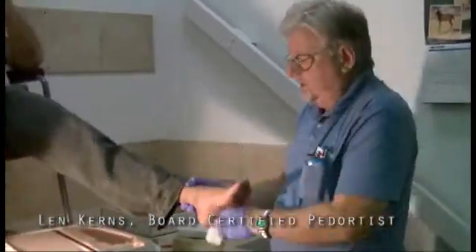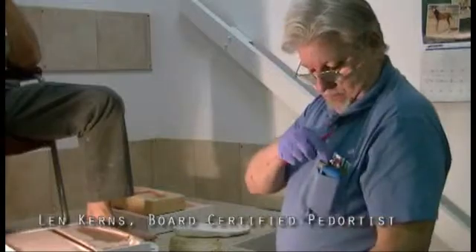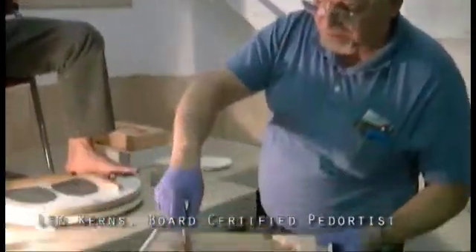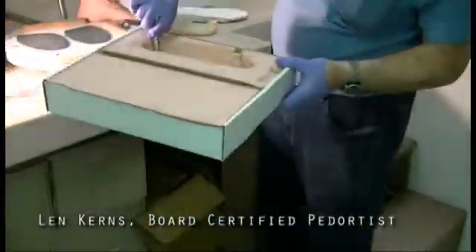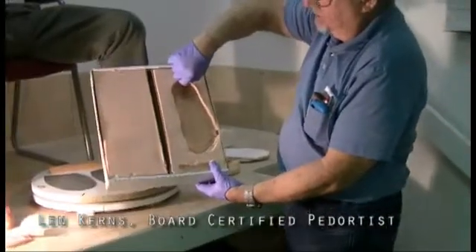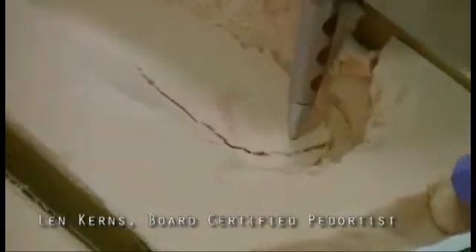And this is what I stress at this point. This is where the new doctors get messed up. Take a pen. Take 2 pens out of your pocket. Hold it down on the lateral side. Approximately, touch it with your finger. Can you see that in the movie? Take it over here. Should be the same depth, approximately.